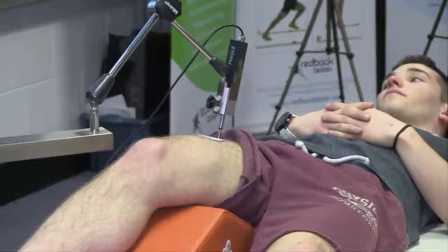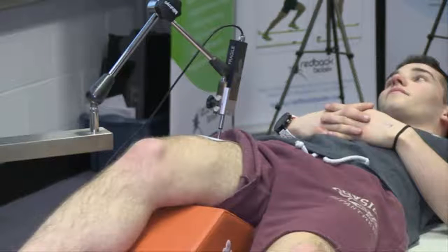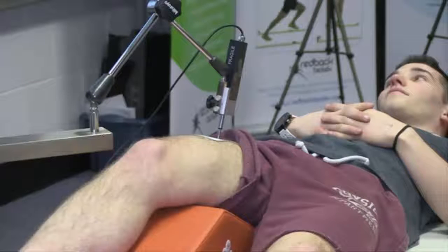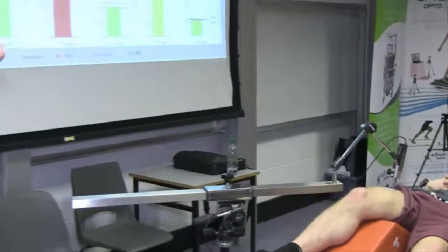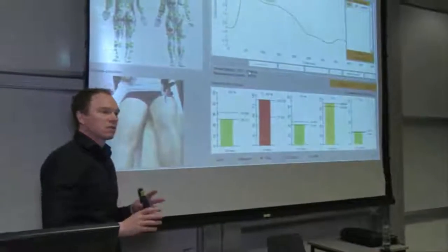Okay, I'll start with 20 now. So, okay, maybe I can try one more to be completely stable. That's it. So what you saw here probably was a little bit of kicking motion. You can see that here it doesn't influence any of the parameters. We stop monitoring here, so what happens later on does not influence the result.